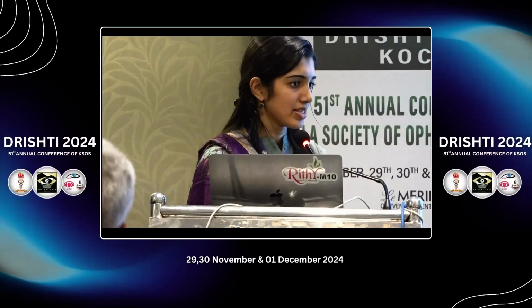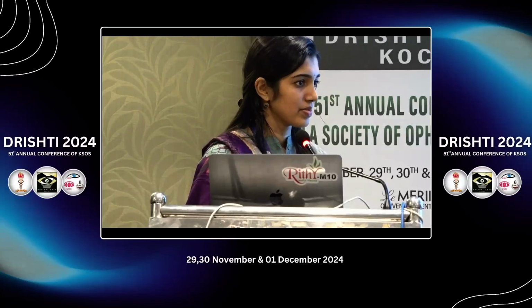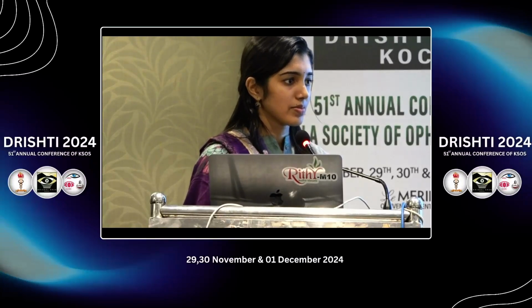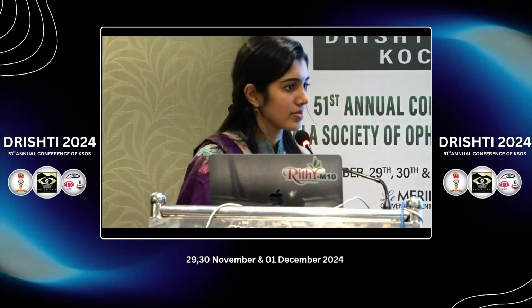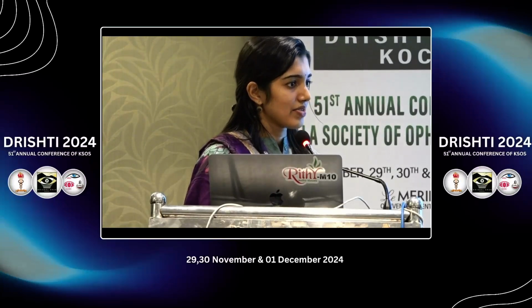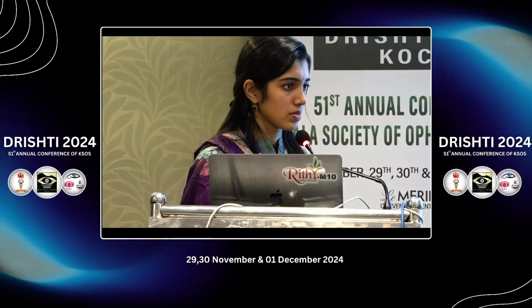For primary IOL implantation, there is a single procedure that we do for patients aged more than 2 years. That means nystagmus naturally you can expect, because the macula develops by the 16th week. Naturally you can expect nystagmus to come and squint to come. Why did you wait for 2 years for this first surgery? Pardon, sir, I didn't understand. See, if you wait for 2 years, naturally the child is liable to develop nystagmus and squint. You are telling primary IOL is done at 2 years, that means you have not done surgery before that. You have to make the child aphakic only, so that the light can go inside and enable the macula to develop. Otherwise, the macula will not develop.